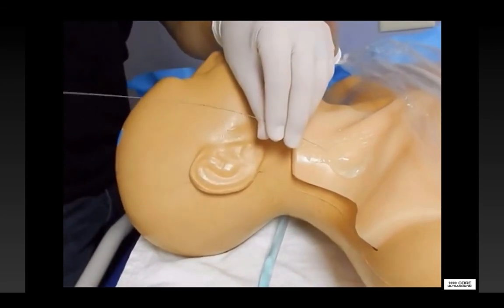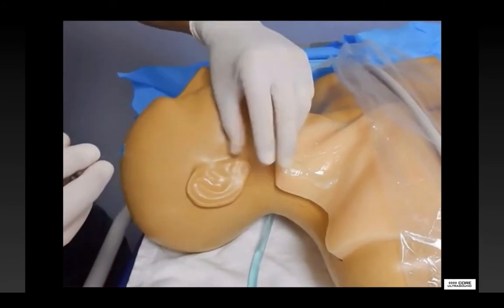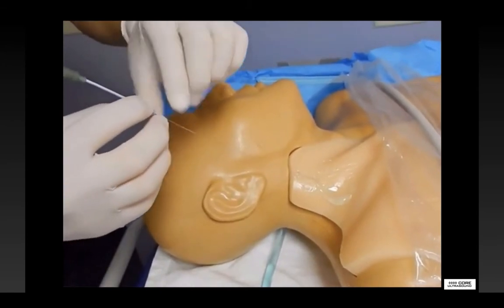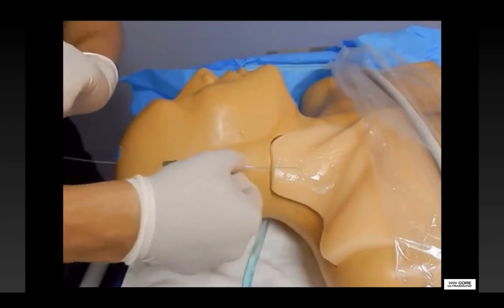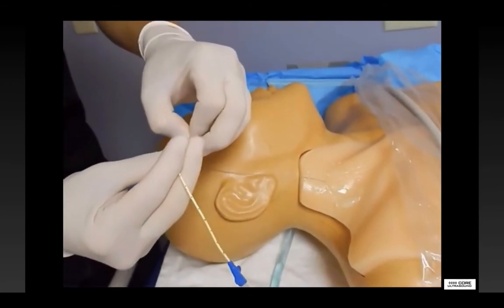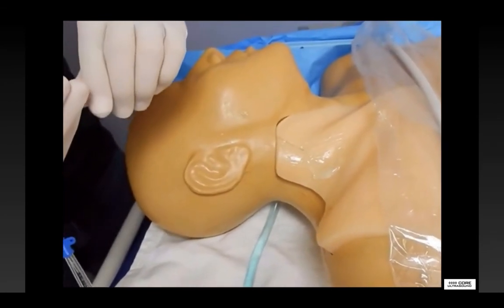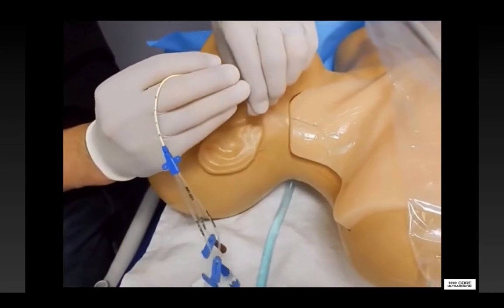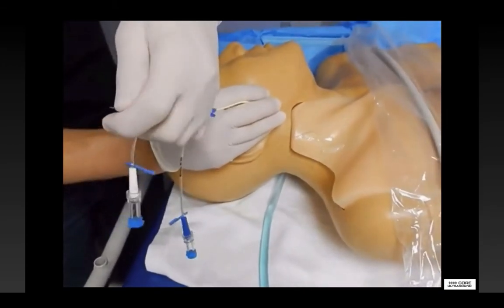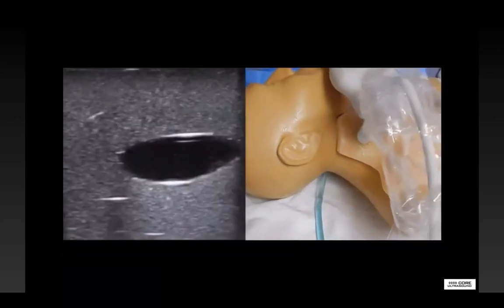Here, we would use our scalpel to nick the skin. We don't use the scalpel to cut down through the soft tissues or the vein — just to make an opening wide enough in the skin to advance our catheter and dilator. Once the skin is nicked, we use our dilator threaded over the wire and advanced through the soft tissues and the vein wall, to ensure that the catheter itself can be easily advanced. You'll see he places the catheter onto the end of the wire and is sure to maintain control of the wire at all times — very cautious not to let go of the wire, as it can be lost within the patient. The catheter should then be advanced slowly over the wire into the vessel.